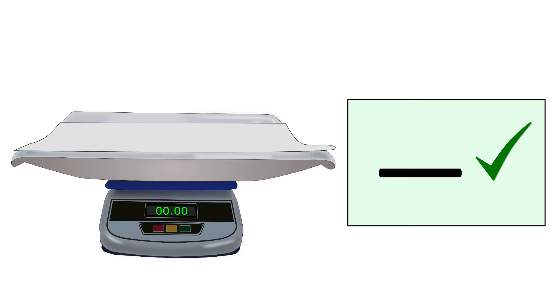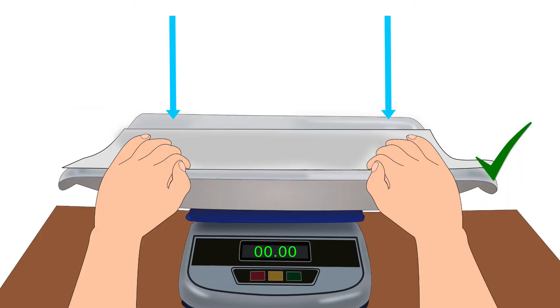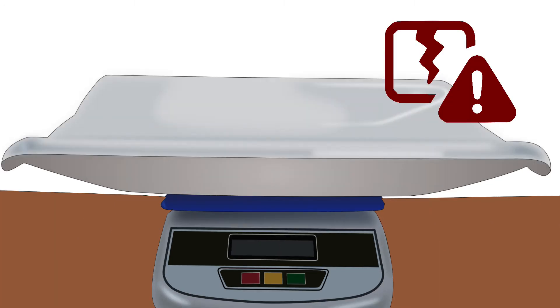Check the accuracy of the weighing scale with standard known weights every week. Do not press the weighing tray with your hand — it could damage the weighing machine.